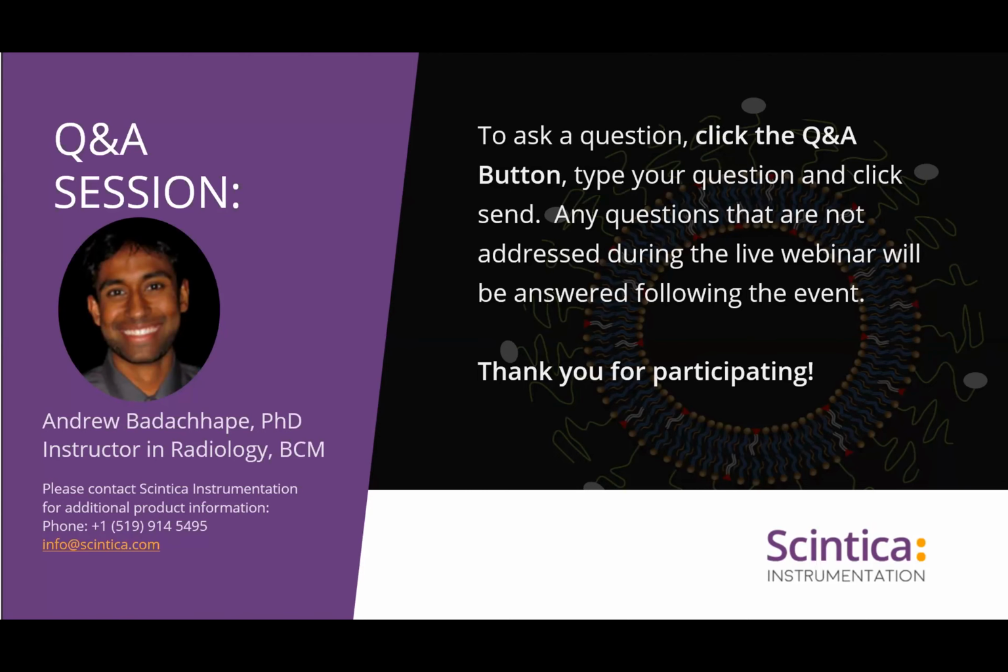We would expect that RPCS volume to be at least lowered in an accreta model, but I think what's going to be more likely for diagnosing accreta is going to be actually looking at infiltration across that junctional zone, so looking for disruption of that space, because in those images we see a very clear crescent pattern just opposed between the placenta and myometrial wall that we think is going to likely be disrupted in cases of accreta when we look at those models.